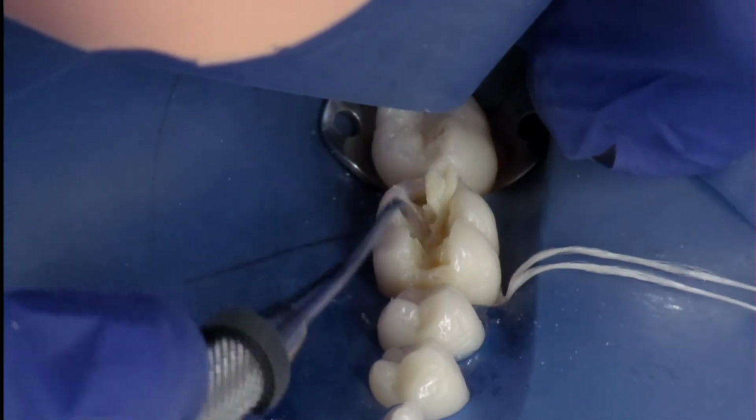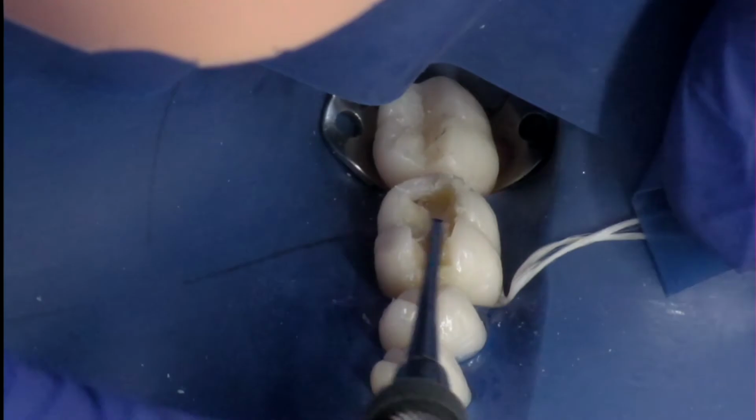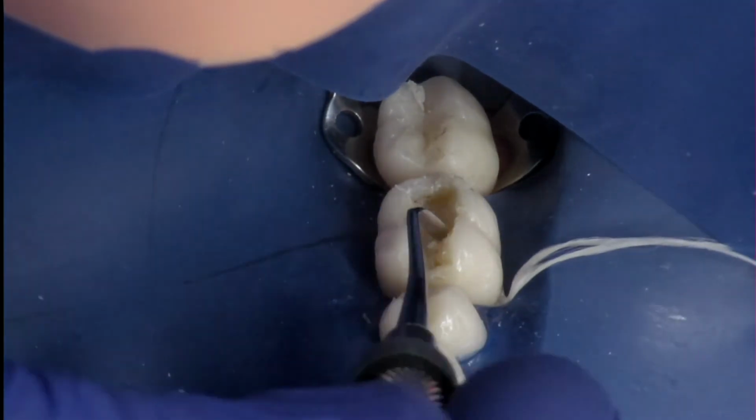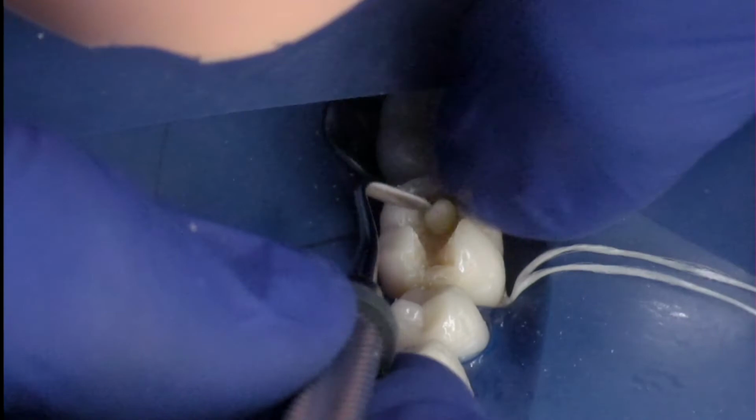Kind of go back to the original plan of doing lobes and small ball increments for each cusp. My goal with every composite restoration is just to build the tooth that I want and spend as little time finishing as possible.